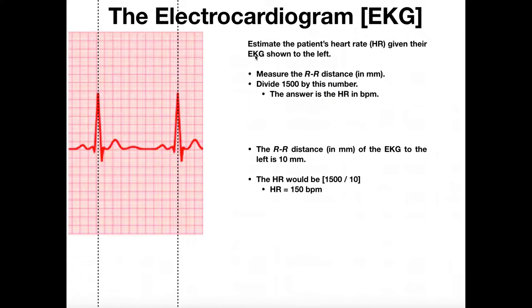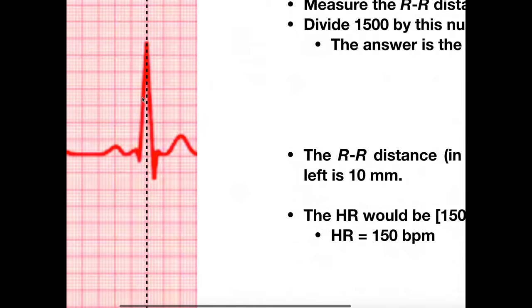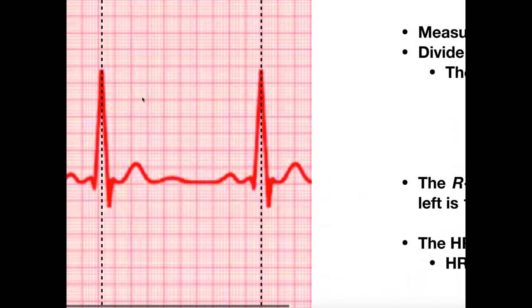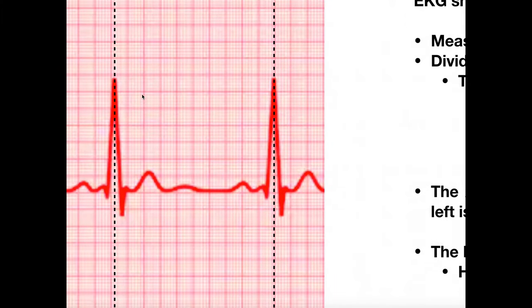Our problem is: estimate the patient's heart rate given their EKG shown here. First I have to calculate the RR distance. Let me zoom in a little bit so we can see this better. The nice thing about EKGs is they're generally recorded on paper that looks like graph paper, and each one of these squares represents one millimeter, so I just count over until I get to the next R wave.